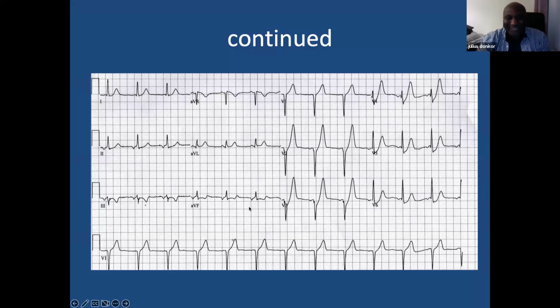So De Winter's T wave is often missed by people, especially maybe registrars, A&E, or even cardiology registrars. It's an emergent MI, a full-blown MI. Maybe in a few hours you get the full-blown picture. So do not mistake that. That is coming.